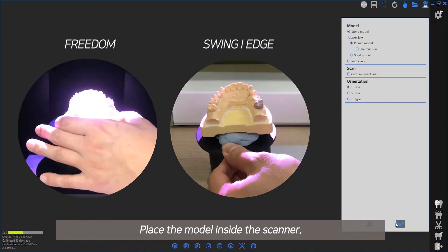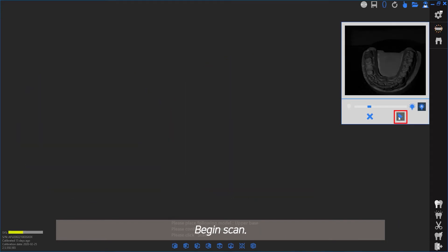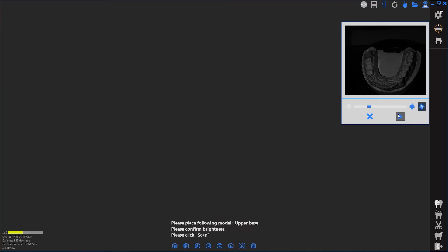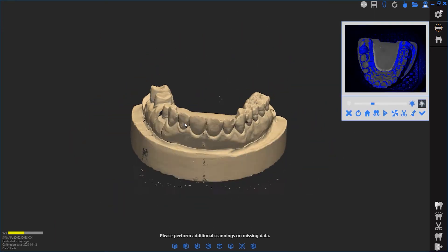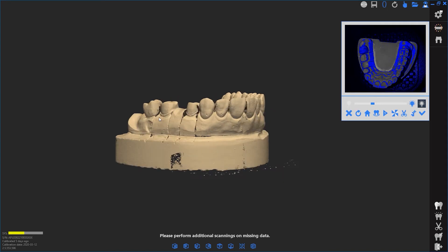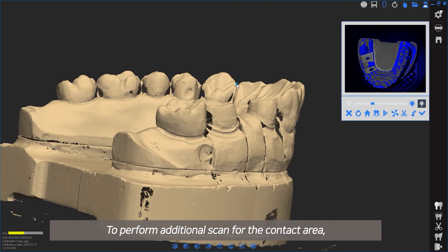Place the model inside the scanner and begin scan. To perform an additional scan for the contact area, remove the prepped dies and use Add Scan.